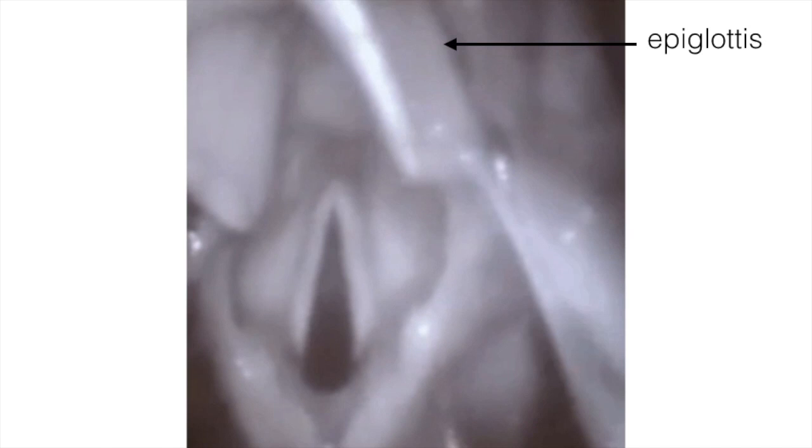Here you will see the endotracheal tube being delivered and placed through the laryngeal inlet into the trachea, completing the intubation. After the trachea has been intubated, the balloon is inflated to help secure it in place, to prevent leakage of respiratory gases and protect the tracheobronchial tree from receiving undesirable material such as stomach acids.